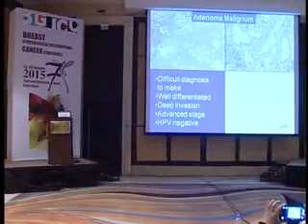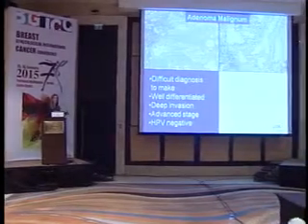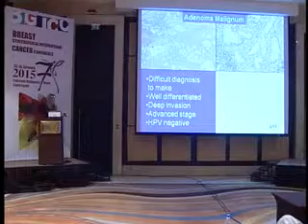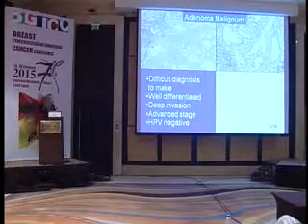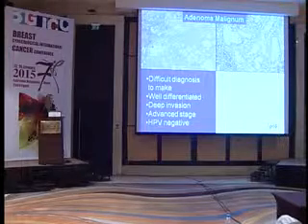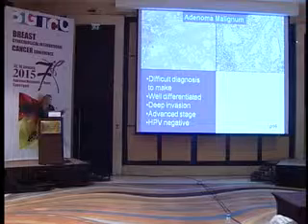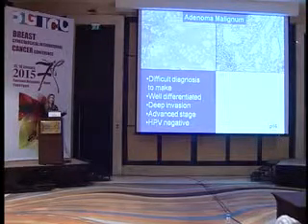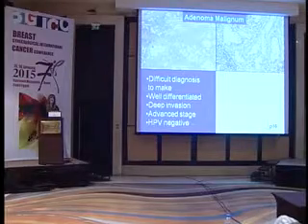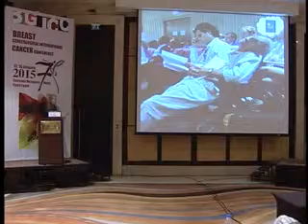Adenoma malignum, why it is so difficult to diagnose. It's so well differentiated. It looks like normal cervical glands. Look at this. But they are malignant. If you look very, very carefully, you'll see a few atypical cells, angulated glands, and deep invasion. Very poor prognosis because whenever they discover it, it's in an advanced stage, and it is HPV negative. Stay with me, 5 minutes, okay?